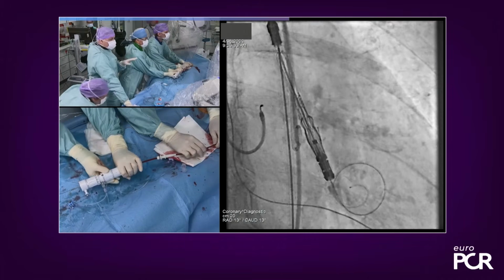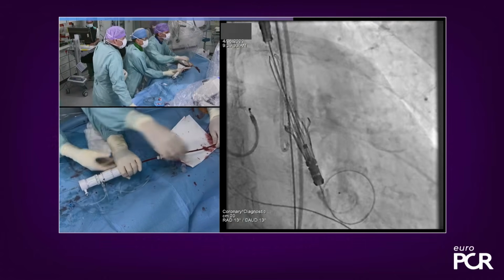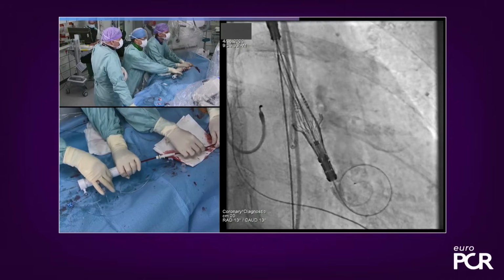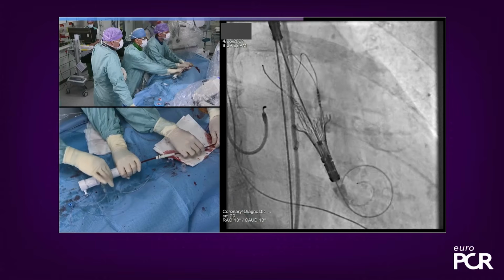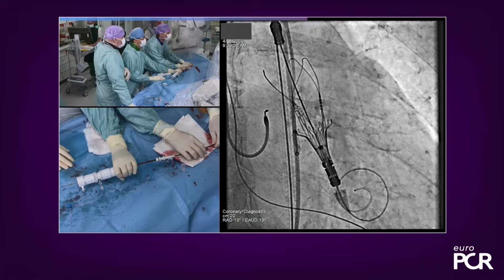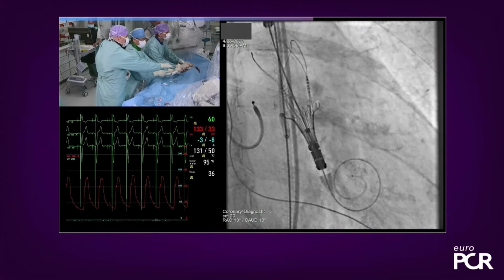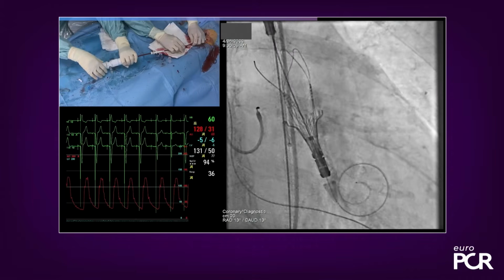That's going to, as I said before, do a top-down deployment. You're going to have, first you see now the upper crowns are open. Gintas is continuing, and now you see the stabilizing arches coming out at the top of the stent frame. Okay? And we can confirm once again that we have a good position with the radiopaque marker. It's just at the annulus level. So next, Gintas is going to pull out that safety pin. He's going to take knob number 2, still do counterclockwise rotation, but now just much faster.